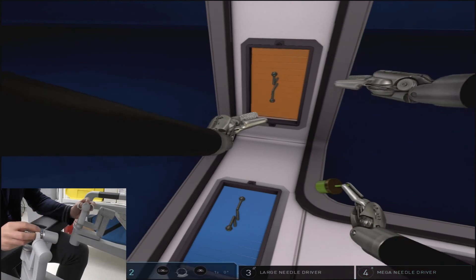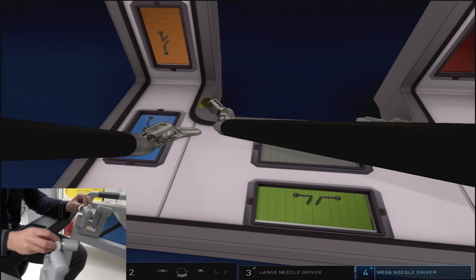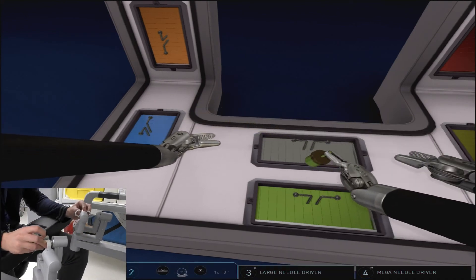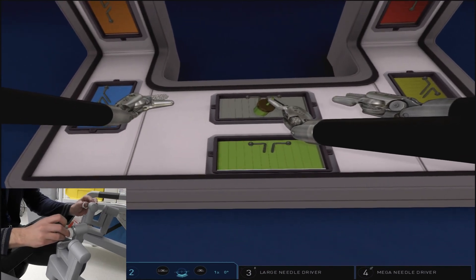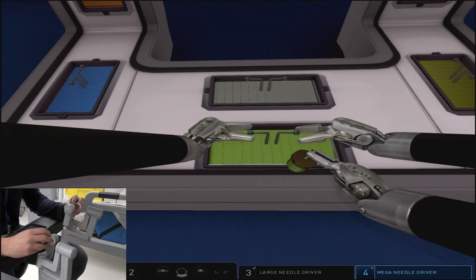Patience is key with this exercise. You can see we make multiple camera adjustments, multiple clutches, and a few swapping of the arms in order to even get back into the position we want to be in before attempting to open the green panel.